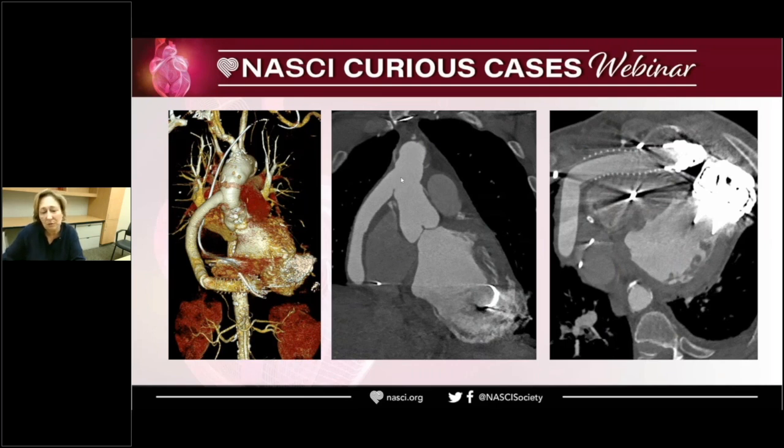The connection is great and beautiful. We can see that this heart, the left ventricle, is markedly dilated. It's very abnormal, but there's really a significant artifact here. After multiple manipulations with the images, we did not see thrombus within the cannula. And here is the 3D image just to show you the physiology of the device.